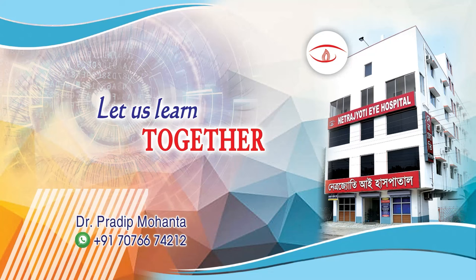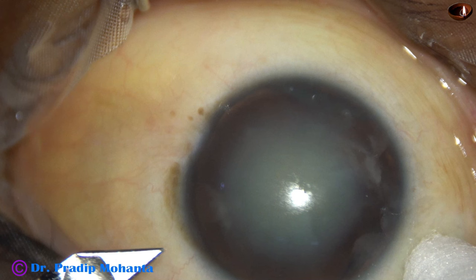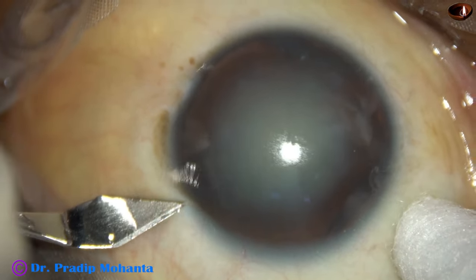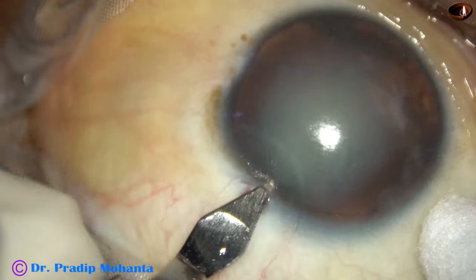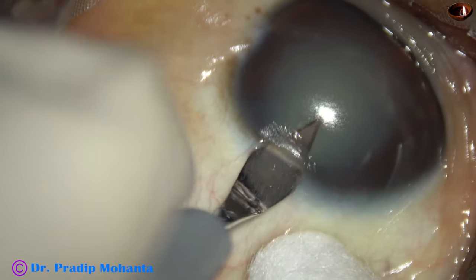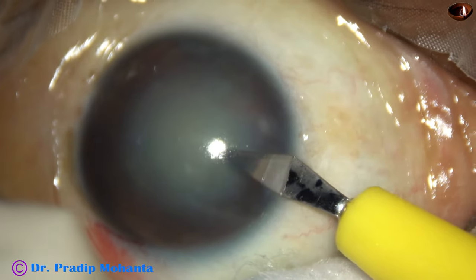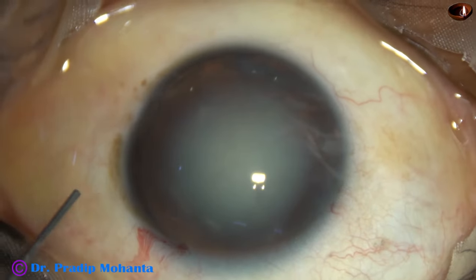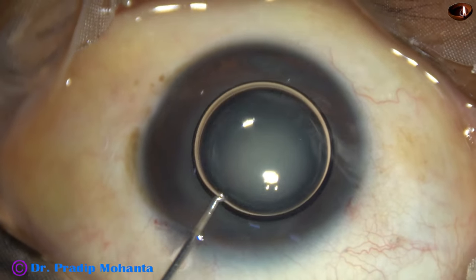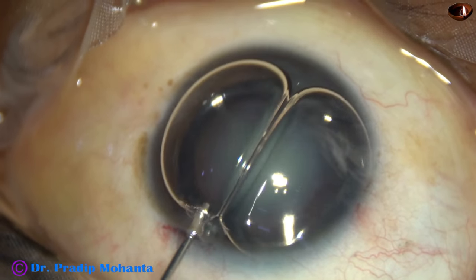Surgery with the non-dominant hand. This is a cataract with zonular dehiscence from 8 o'clock to 11 o'clock. I am placing the incision at 2 o'clock to avoid the area of zonular dehiscence. I had to do this surgery with my non-dominant hand because this is the right eye of the patient.